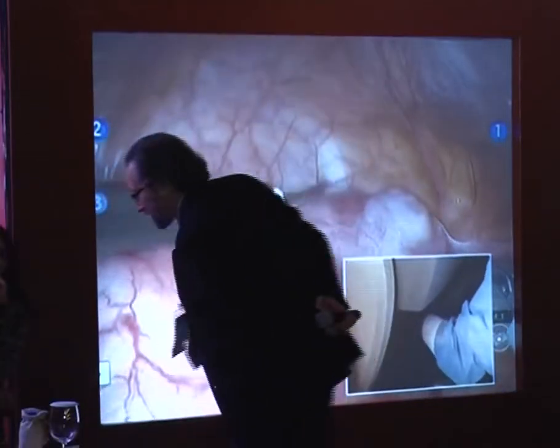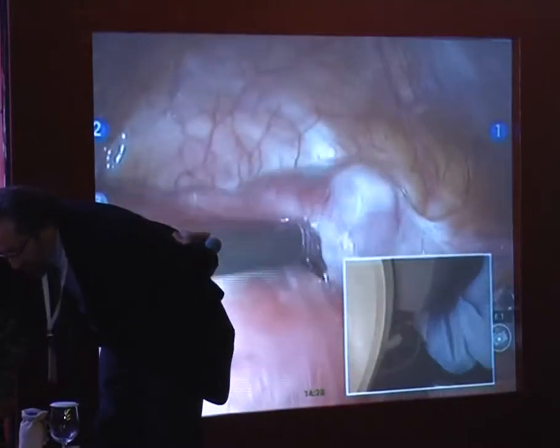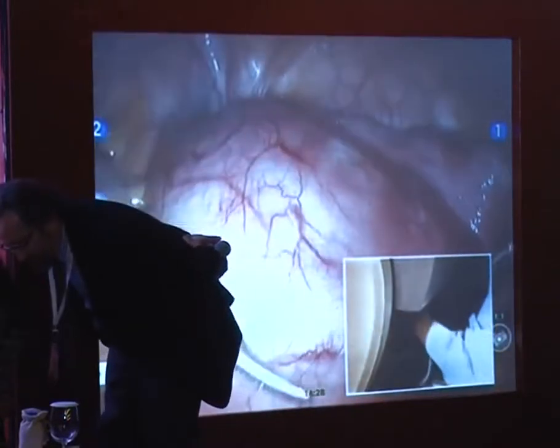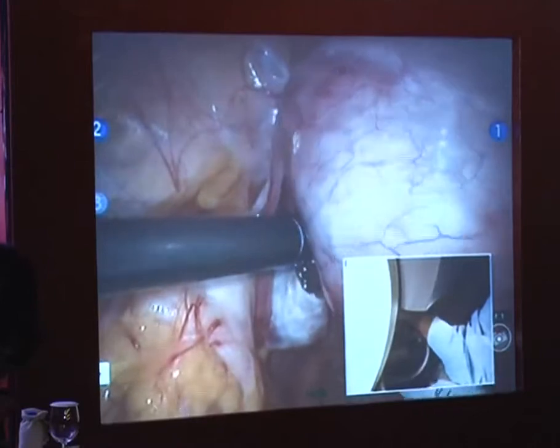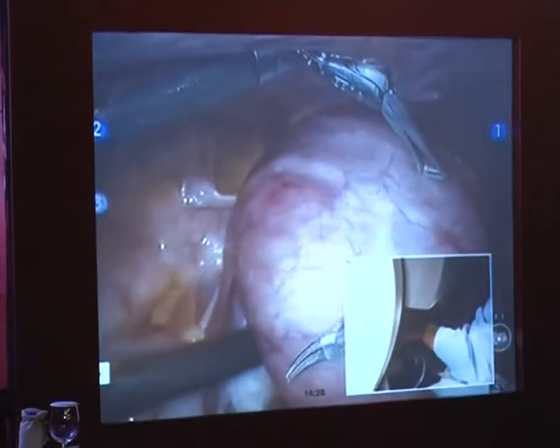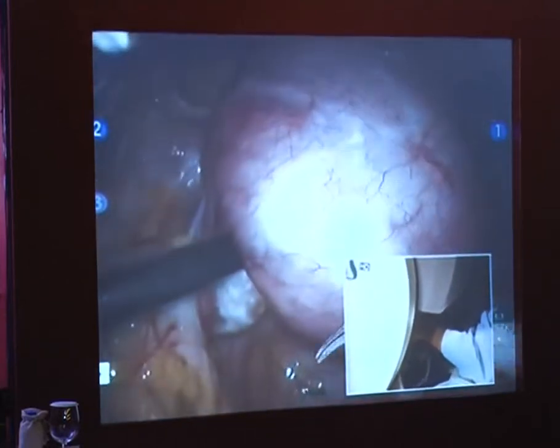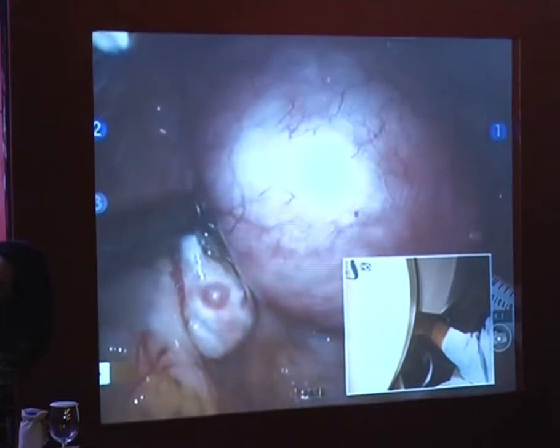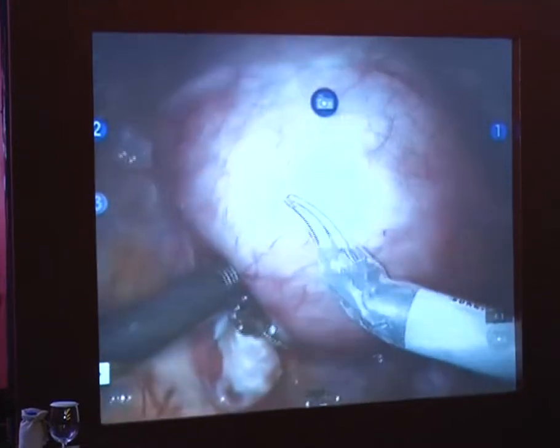The horizontal would be nice. However, looking at this, it might make more sense to make a vertical incision, only so that I could avoid getting into the cornua here, which is where I don't want to be. Now go ahead and drop the uterus back down into the pelvis, just like that. That actually helps a lot. It just helps me figure out the best orientation for pulling this out. I think this is going to be it right here. Okay.